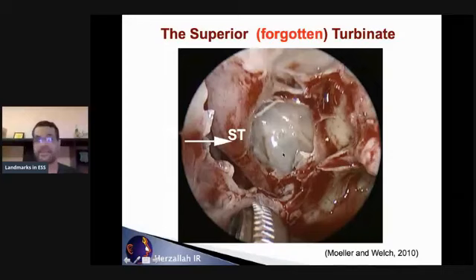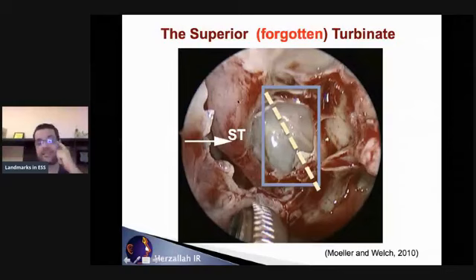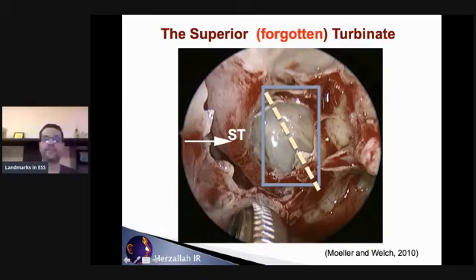Now, the classic teaching is to have this parallelogram, or this region lateral to the superior turbinate. Obviously, we are now looking at the left side. And then you say, okay, I'm going to have this line that divides this rectangle into inferomedial area and superolateral area. If you are entering the sphenoid sinus transethmoidally, then you need to go through the inferomedial triangle, right? So this is going to be called the transethmoidal route.